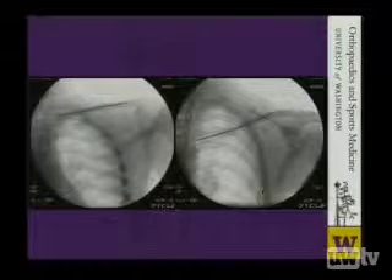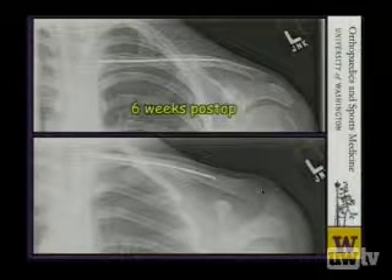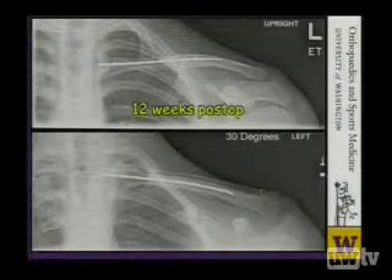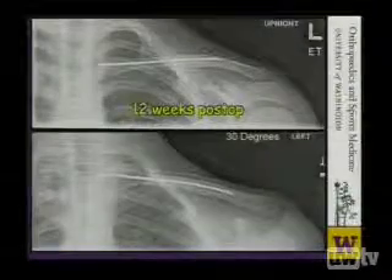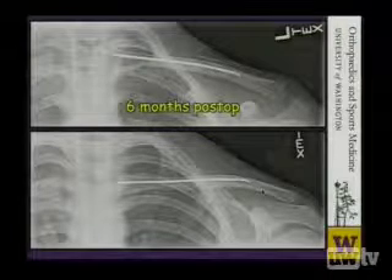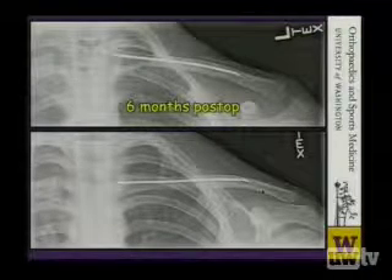As a polytrauma patient, he's going to need his upper extremities healed up as quickly and as functionally as possible — another good reason to operate on the clavicle in addition to the femur. Dr. Krieg nailed this fracture with a flexible titanium nail. At six weeks, you can see evidence of fracture healing without any displacement. At 12 weeks, even more fracture callus and the fracture is beginning to become fuzzy. And at six months, the kid's totally healed and has a fully functional left upper extremity.